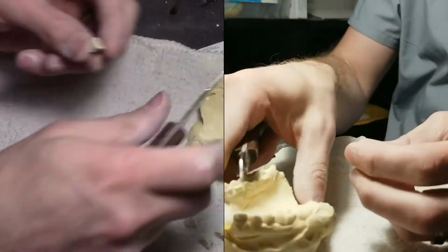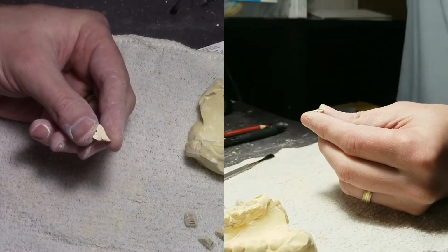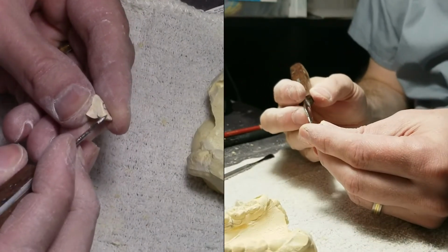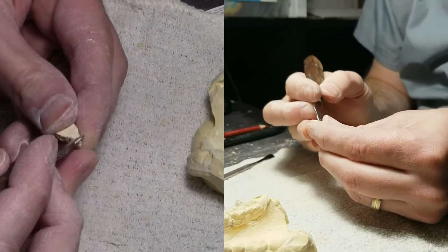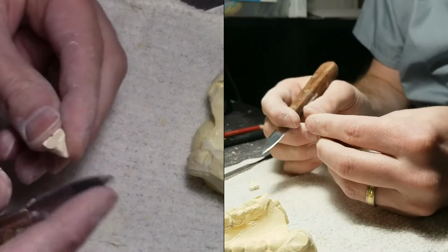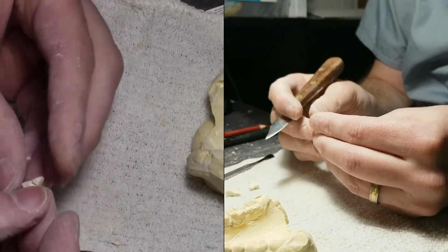So, I told y'all I don't touch. But hopefully you can tell. See if I can zoom in just a tad. Well, wrong way. Hopefully you can tell it's rough where it broke. And I'm really lucky that it broke. So I'm just going to smooth that just slightly. I'm not taking off anything, I'm just kind of smoothing it. So it's just rough where it was attached to the other tooth. Alright, there we go.